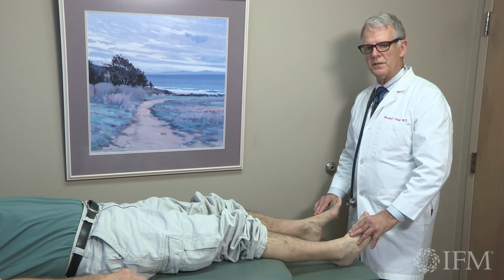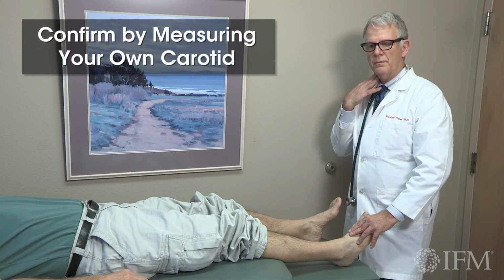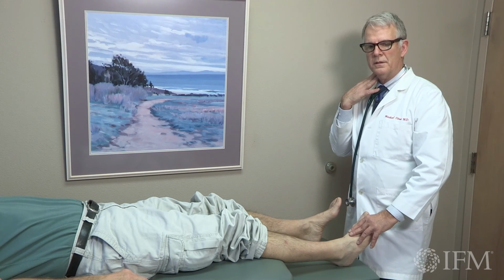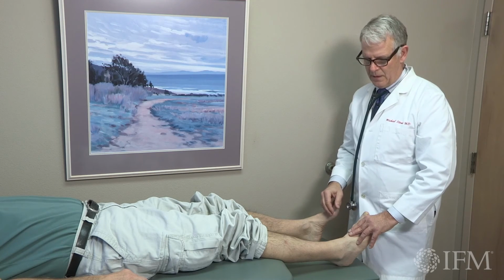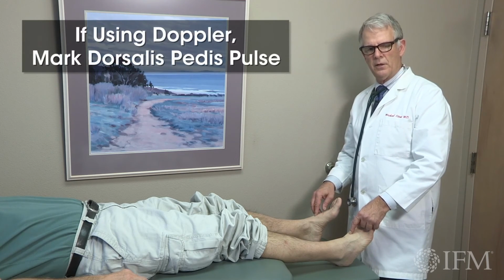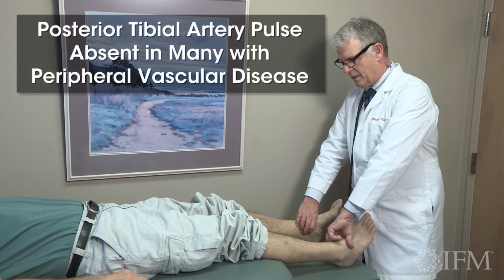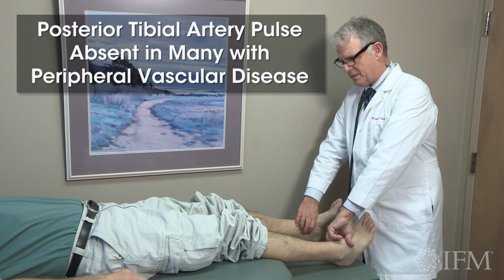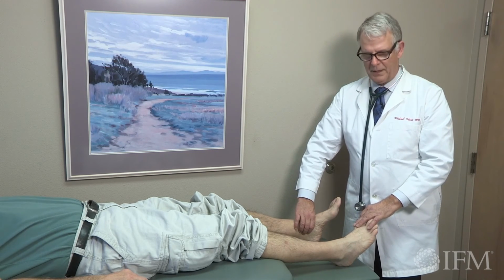And sometimes you just have to quiet yourself to pick it up because it's not always bounding. And you often are going to feel it just fairly lightly under your finger. If you wonder whether it's your own pulse, go ahead and reach up and feel your carotid pulse and assure yourself that you're actually feeling the patient's pulse. So sometimes you have to make a mark because that's where you're going to use your Doppler if you're doing an ankle-arm index. To go to the posterior tibial artery, which is absent in many people who have peripheral vascular disease, your positioning again is just behind the medial malleolus, and you should be able to pick it up.